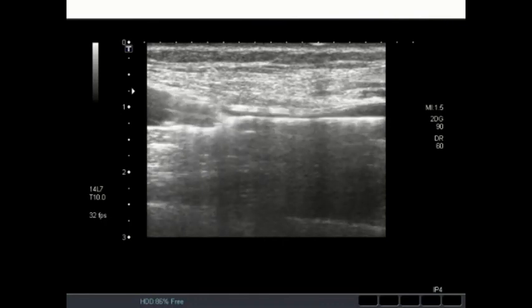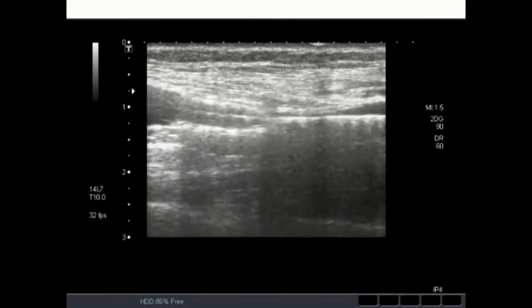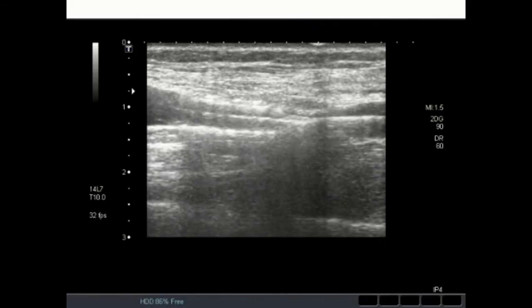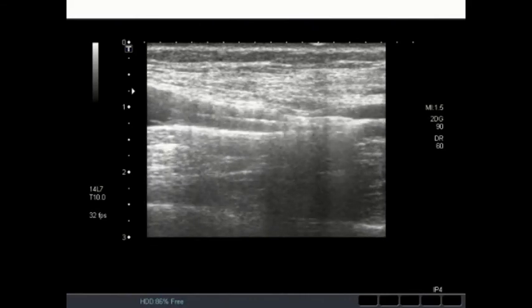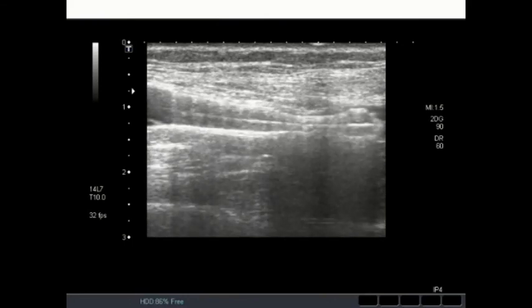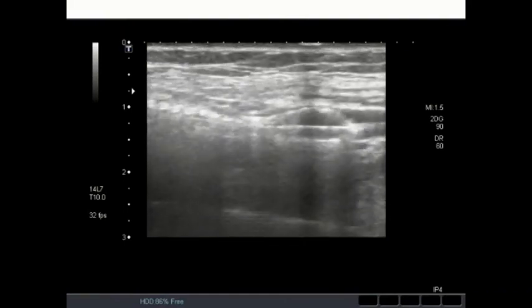Assistant holds the probe. Don't move. Don't move. Then I implant the stent like this. It is a proper size of the stent.